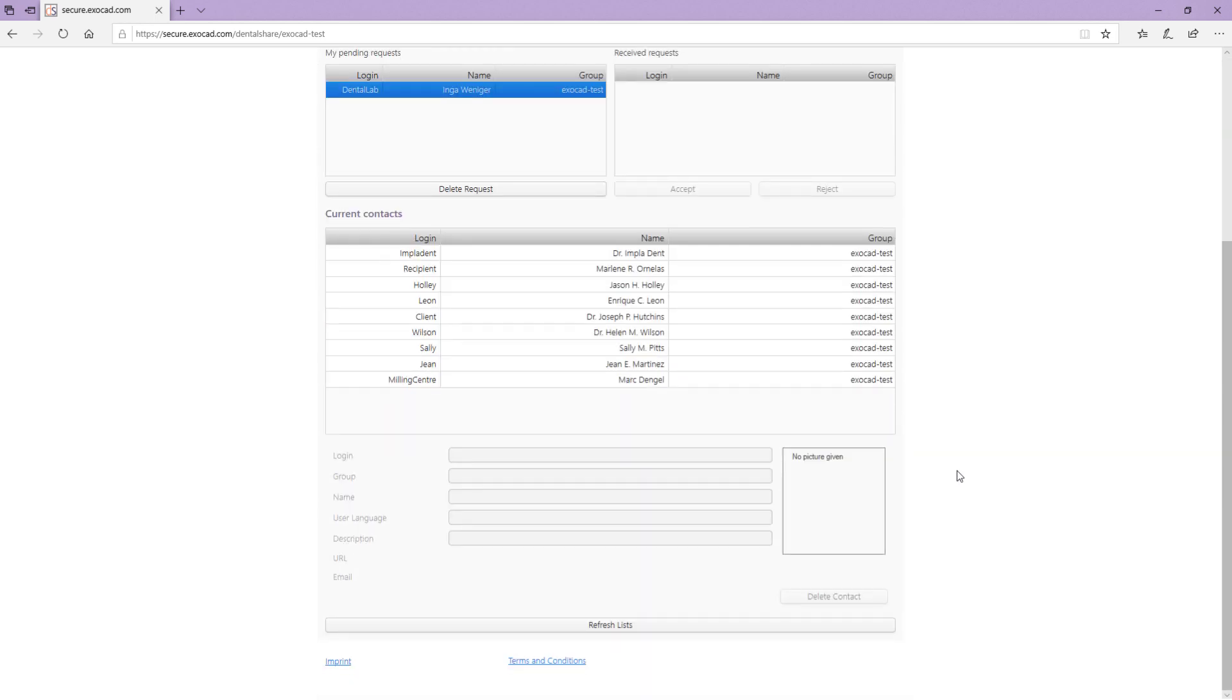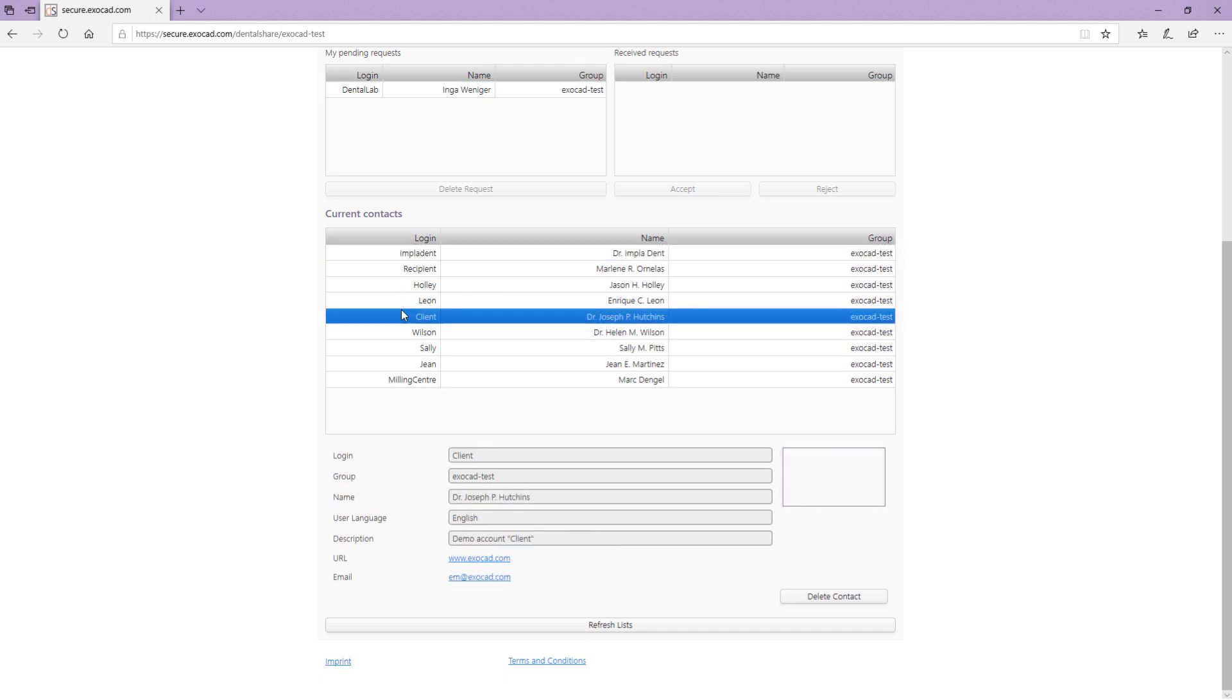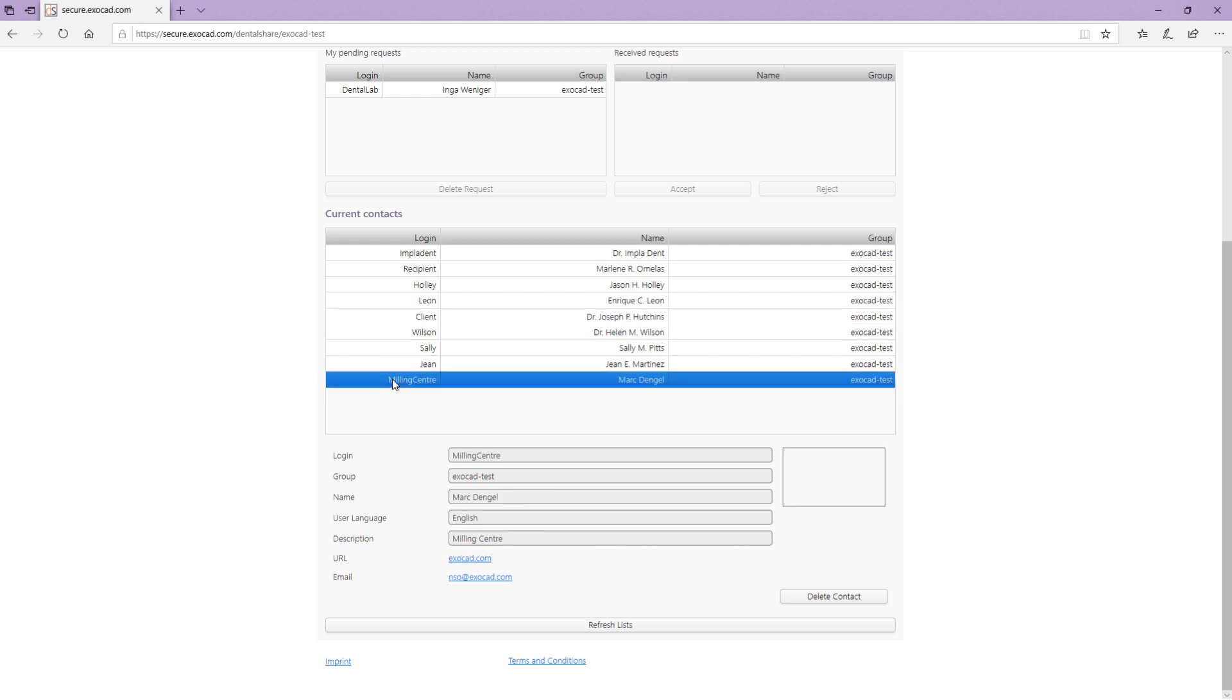The current contact list shows all your current contacts with their details. To delete a contact, select it in the list and click Delete Contact. If you have made changes to your contact lists, click Refresh Lists to update all lists.